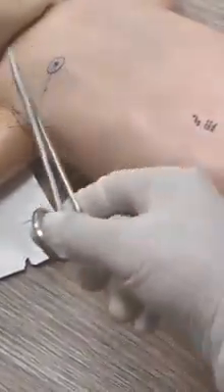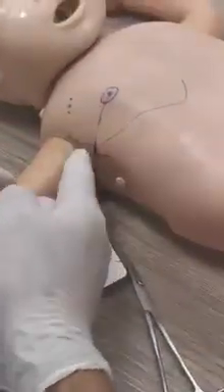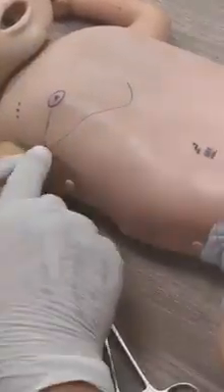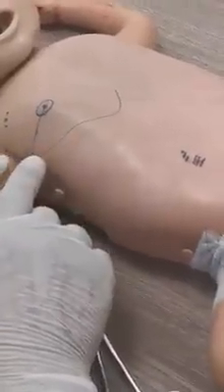Imagine this is the one. If I start to wrap it like this, it will be a figure of 8. So I will leave it like this. I will not take any more, but I know that I will go here now. Before insertion, I take the incision and make some opening. I don't like to open the muscle wall and the pleura. This is not my technique. I only open the muscle, but I don't open the pleura.